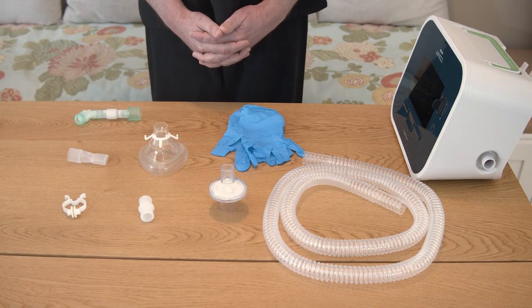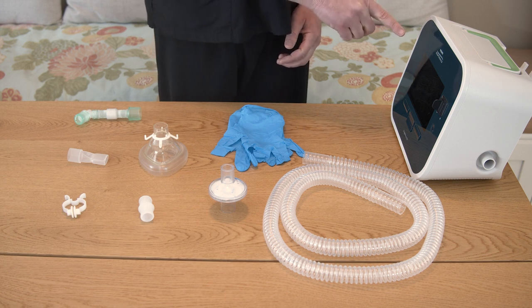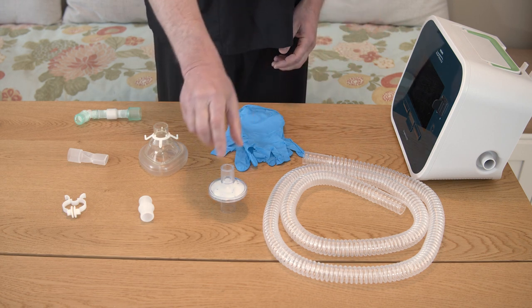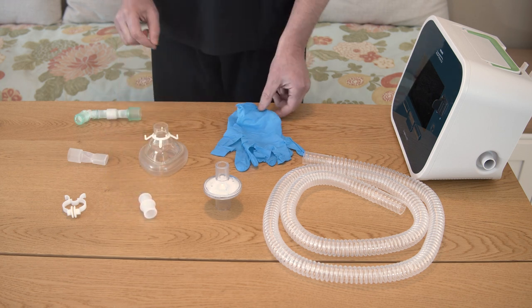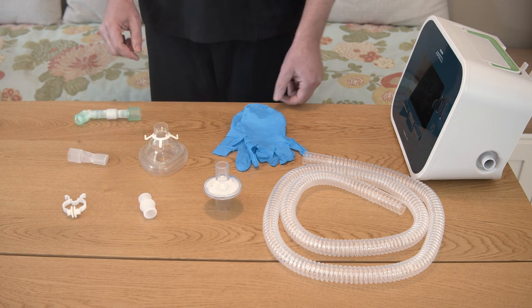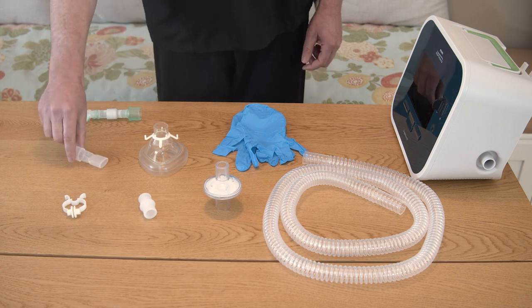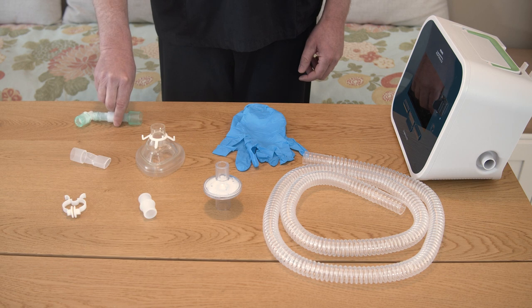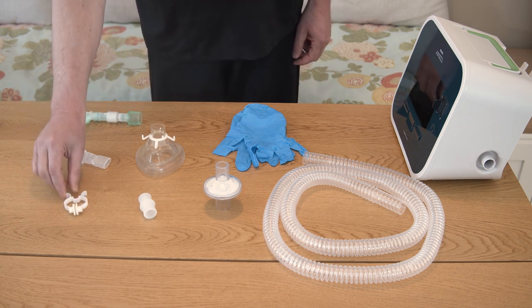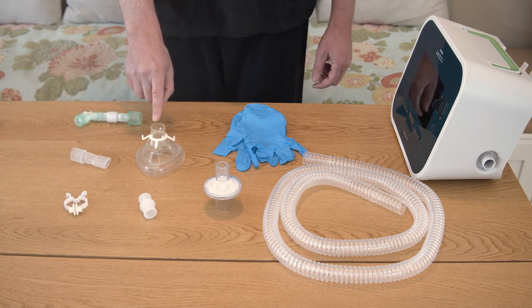Gather the equipment and supplies you need: a cough assist device, tubing, a filter, an adapter, non-sterile gloves if you want to wear gloves, a patient interface such as a mouthpiece, face mask, or trach tube adapter, and a nose clip if needed. For this video, we'll be using a face mask.